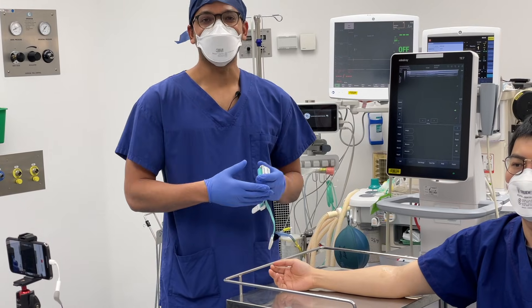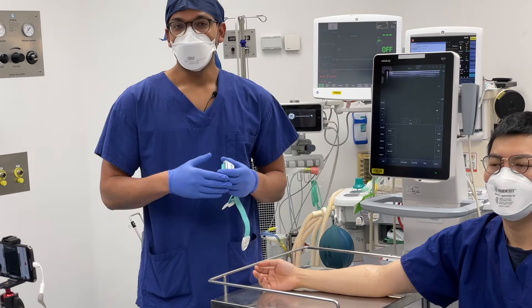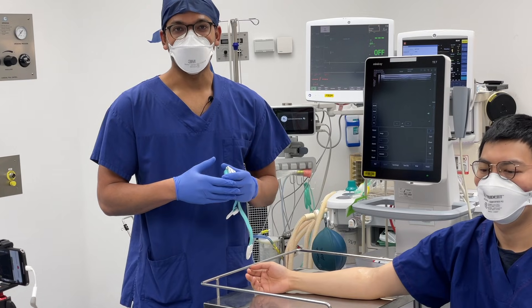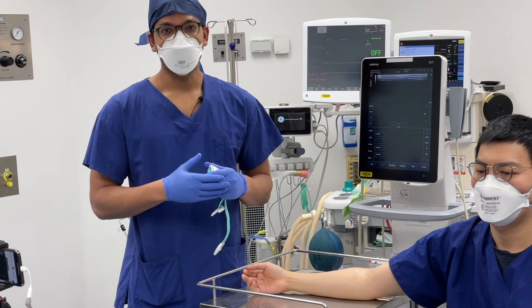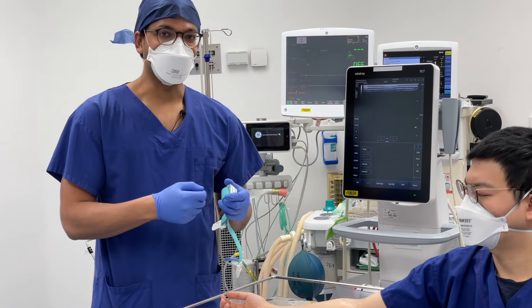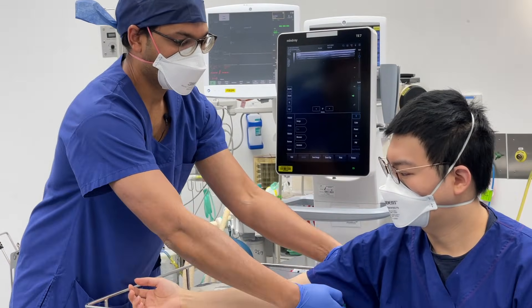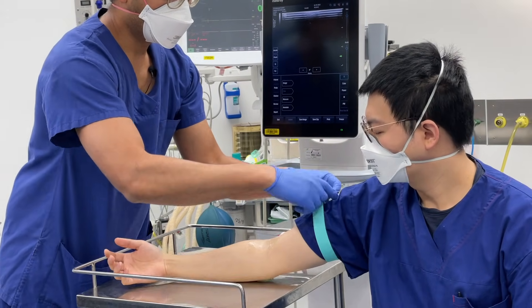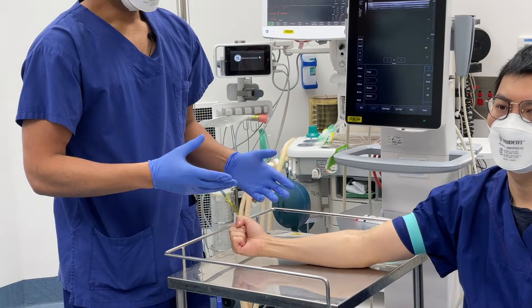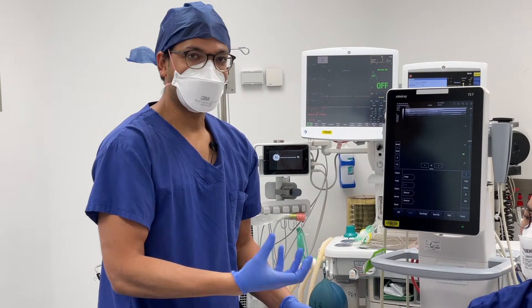Now I'm going to show you veins on a live volunteer with ultrasound. This is really useful for the most difficult and deepest veins, and when you're having trouble getting vascular access, ultrasound is an absolute game changer. First, as always, I'll get my setup ready. I'm not going to focus on all the details of cannulation — just showing you the veins. First, apply the tourniquet. This promotes arterial flow without blocking it, but prevents venous return, which increases pressure in the veins so they stand out and are easier to see.